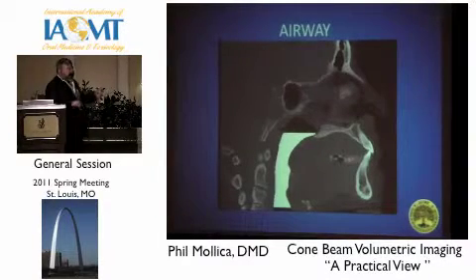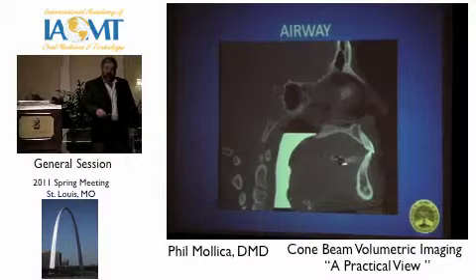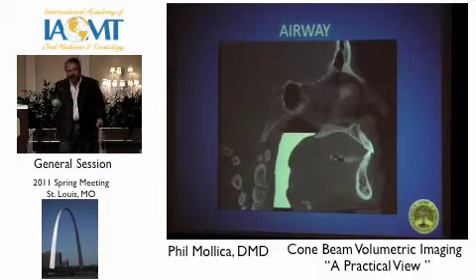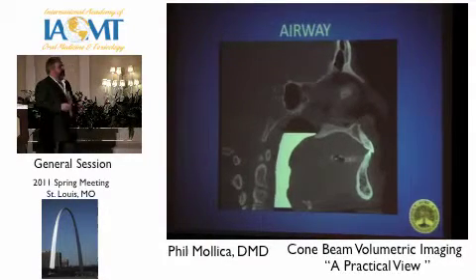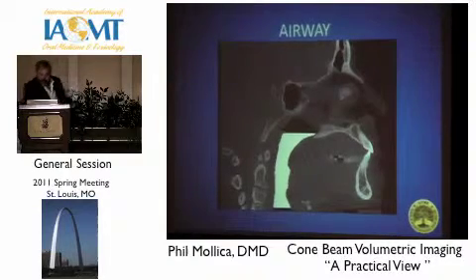Airways. Sleep apnea. On the same picture, we can analyze the airway. And you know what? I didn't bring this with me, but you can actually get a three-dimensional model of the airway, and rotate and look around. All the students that come to the school, everybody gets an ICAT. So we get to look at it, and they go, oh my God. Okay? So we can get a three-dimensional model of their airway.